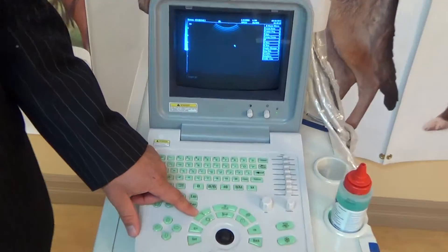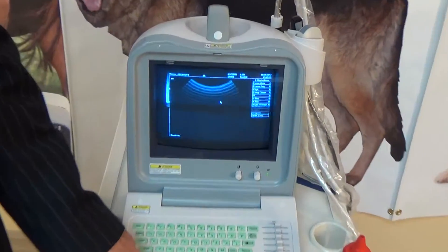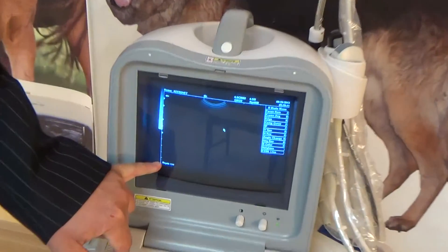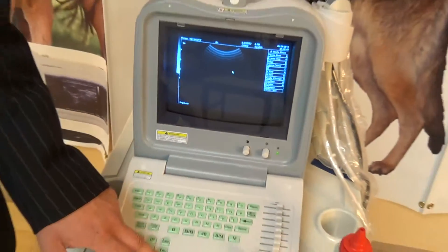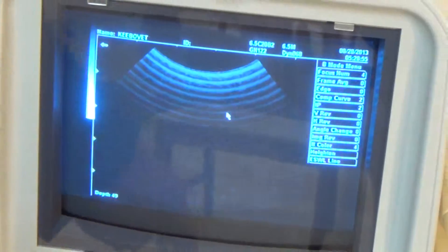Moving along, there's another simple button that's kind of like a zoom button — it looks like a magnifying glass. This controls your depth, so you use it to hit the depth all the way in or all the way out. You can see the depth control here; it starts in millimeters and then converts to centimeters. You zoom in for a lesser depth if what you're looking at is in the near field versus the far field, then just go back to the zoomed-out setting.